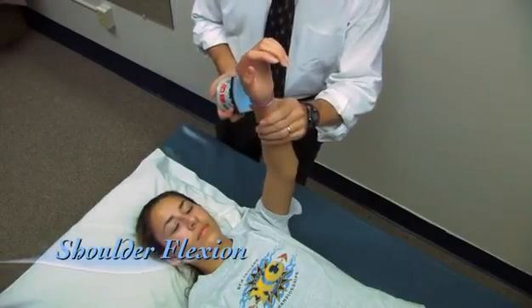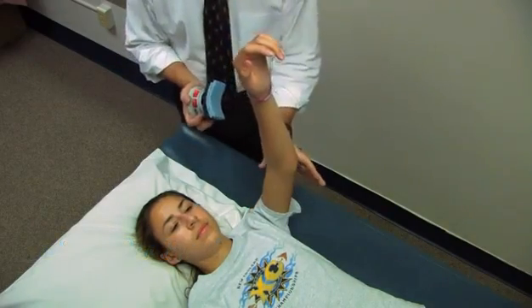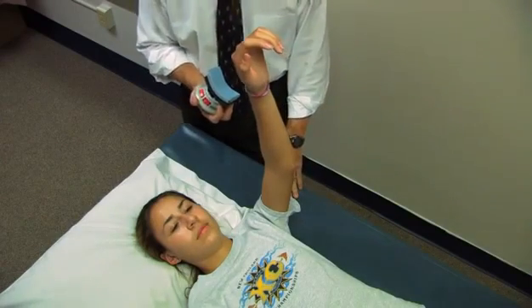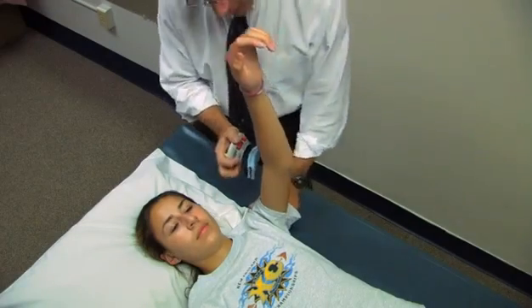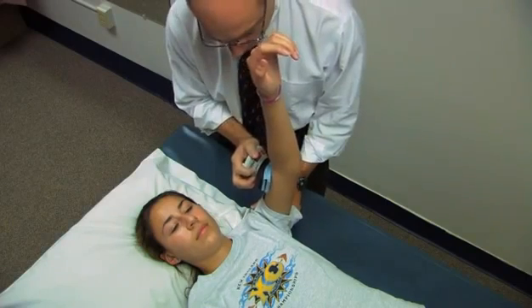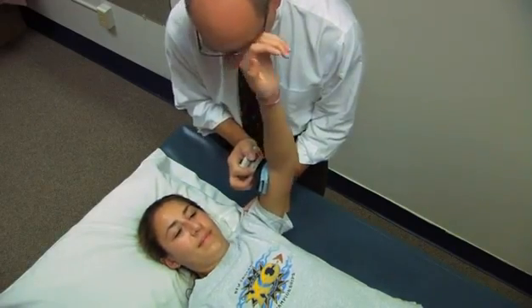First we're going to measure shoulder flexion. That's done with the shoulder at 90 degrees, the arm vertical. I'm going to place the device just proximal to the elbow. I'm going to ask her to take a second or two to come to a maximum effort, then continue to push into the device as hard as you can until I say stop. Go ahead — harder, harder. And relax.